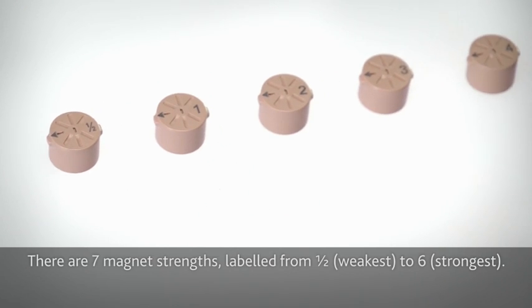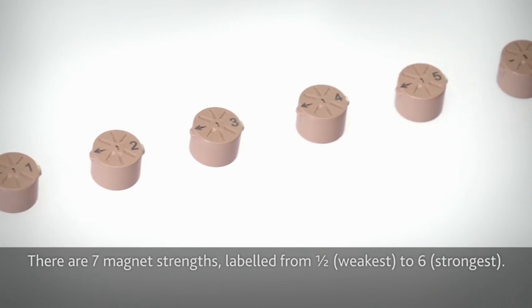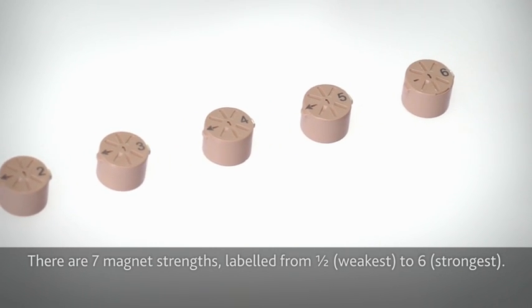There are seven magnet strengths, labelled from half, the weakest, to six, the strongest.